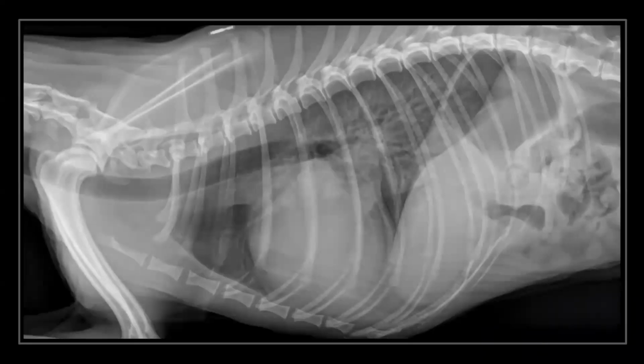So here's a classic example of a cardiac case. The mouse has left me again. Oh, there it is. Sorry guys, the mouse is giving trouble. What we see is a significant infiltration in this caudodorsal lung field, and it's actually obscuring this portion of the heart. And if we look closely, I would imagine that right here is the atrium.